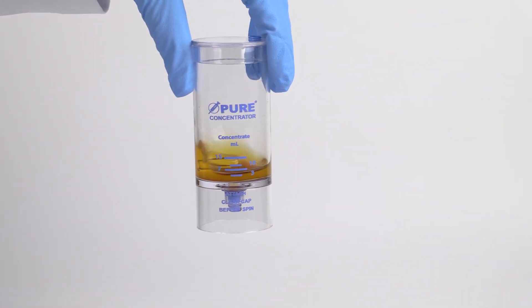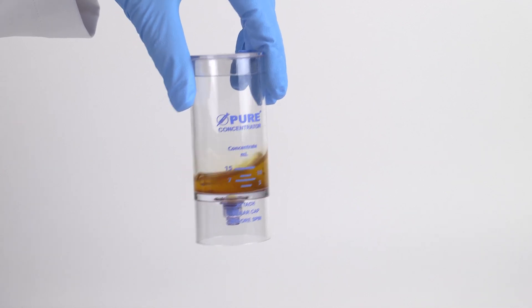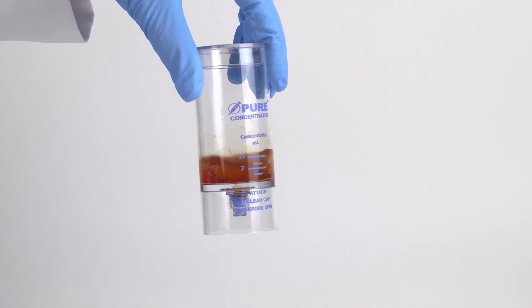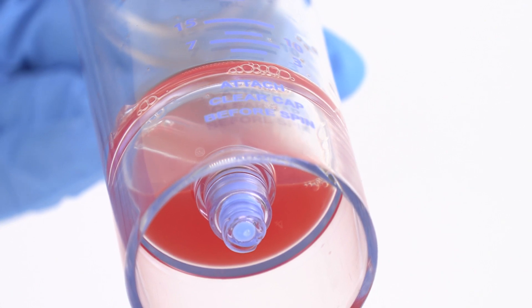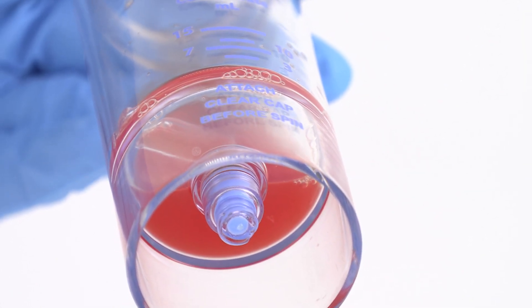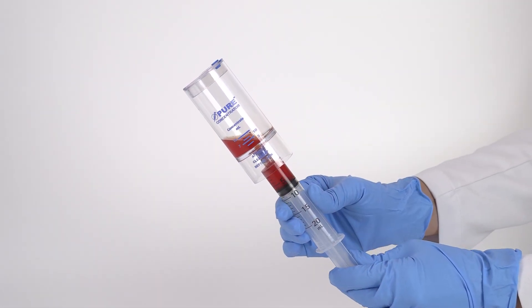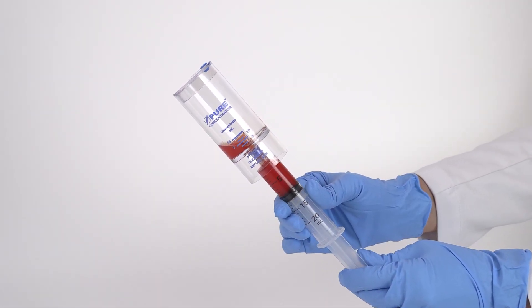Re-suspend the platelet buffy coat back into the plasma by rocking and swirling the device back and forth. Do this until all of the platelets have been re-suspended into the plasma solution and are no longer visible at the bottom of the device. Then attach the syringe to the needleless port and tilt the device to aspirate the PRP.